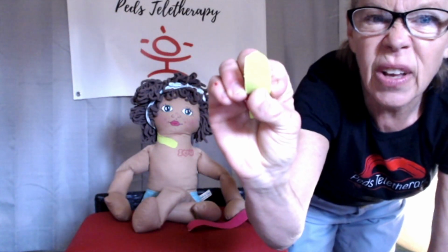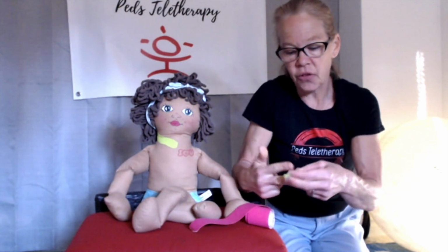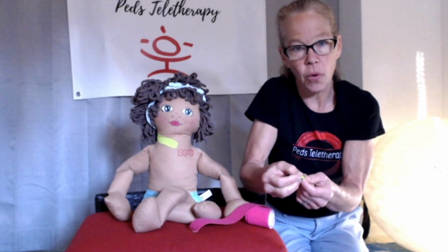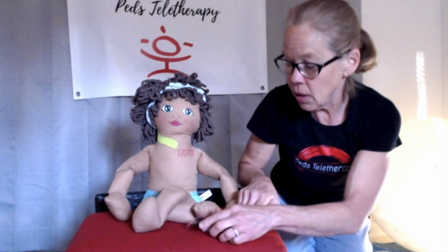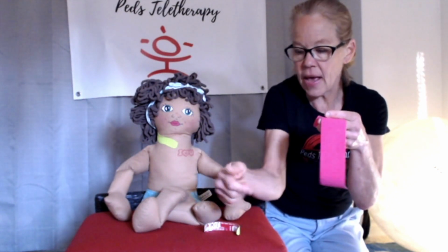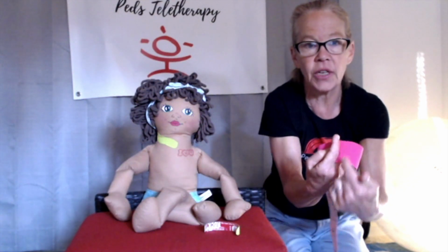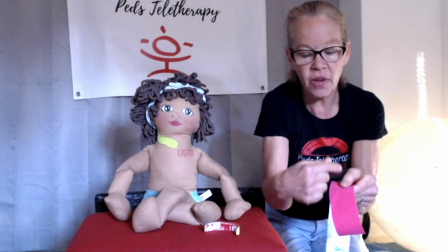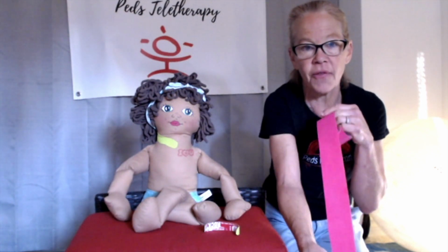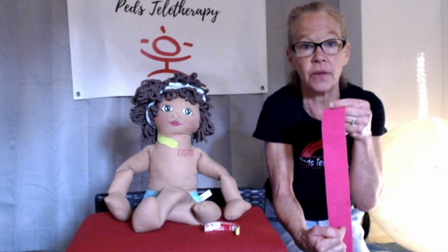Rounded borders tend to last longer, okay? And so never cut straight across, do a rounded border. And the other thing about it is when you're using the 2-inch rolls, we don't really cut as far as length. If I needed a short piece, we don't cut this direction for a short piece. We always cut up the seam of the fibers this way, all your cutting is done in this direction.